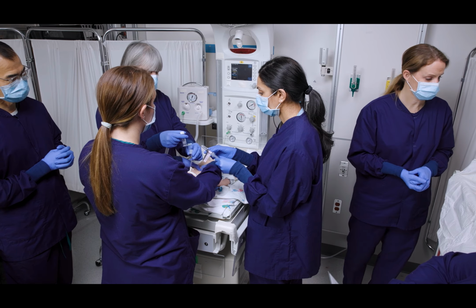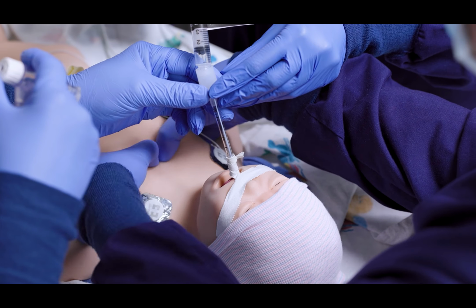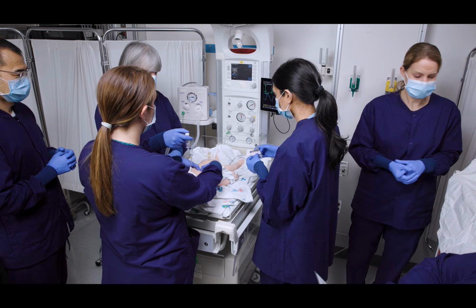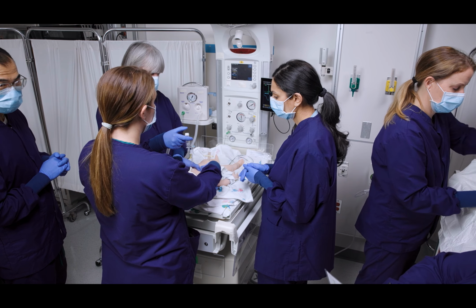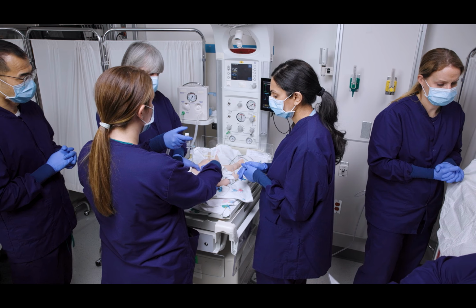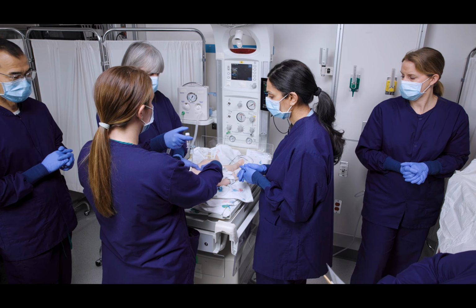Disconnect the ventilation device from the endotracheal tube and deposit the epinephrine into the tube connector. Endotracheal epinephrine does not require a normal saline flush. Reattach the ventilation device and continue ventilations and compressions. The recorder should acknowledge the intervention, document the time, and alert the team when 1 minute has passed since administration.